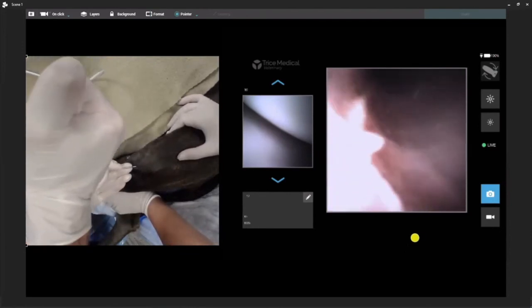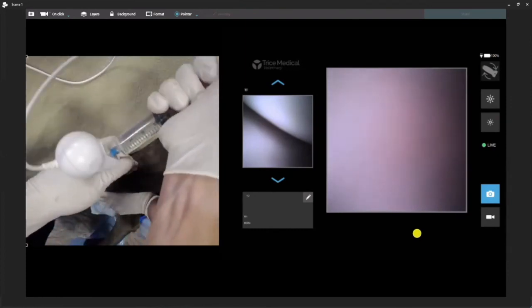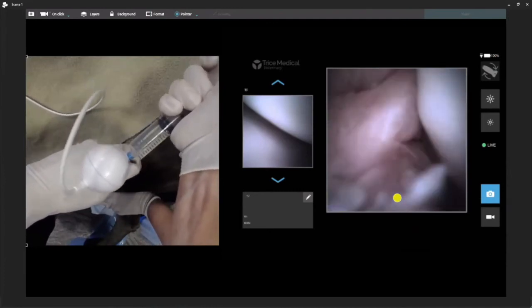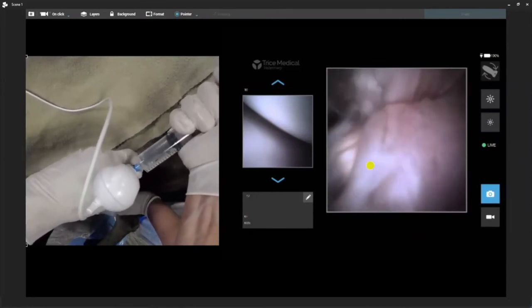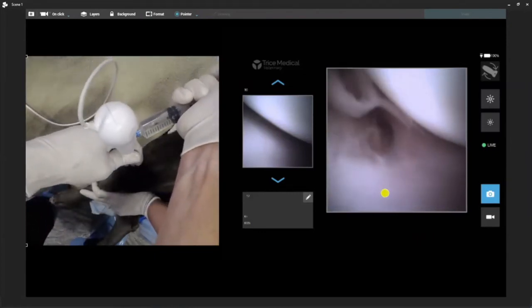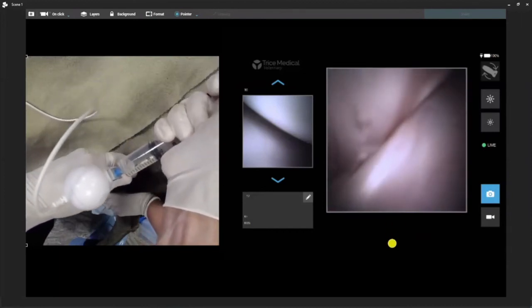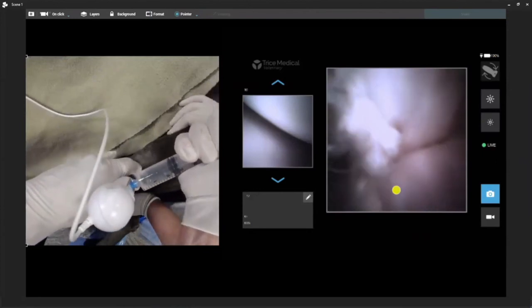Working our way down the femur, around and up into the notch. We can see very nicely — there's the caudal cruciate. There's the cranial cruciate. There's your cranial band and your lateral band. Let's go back under the lateral femoral condyles to the area of our meniscus — we are all the way back, there is our lateral meniscus. I think you guys can see that pretty nicely. Lateral meniscus is right there. There's our criss-cross of our caudal band and our cranial band.